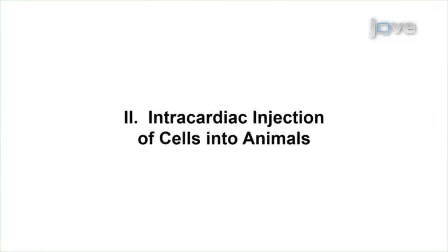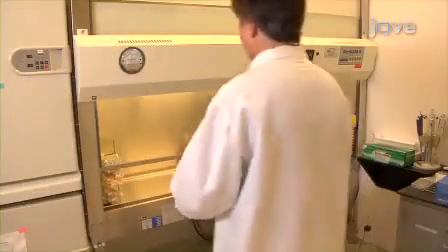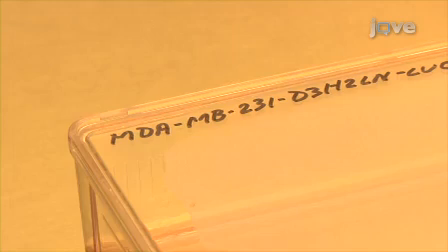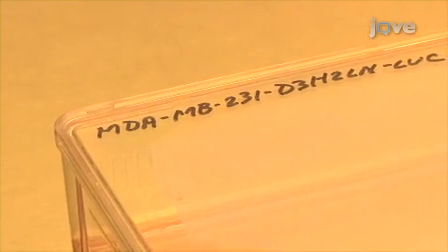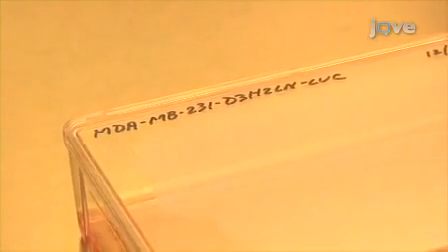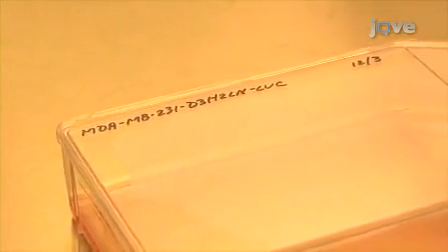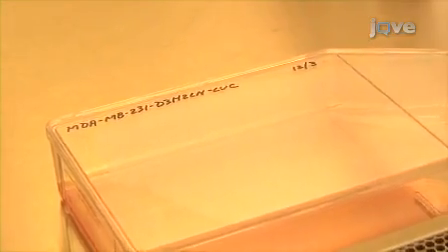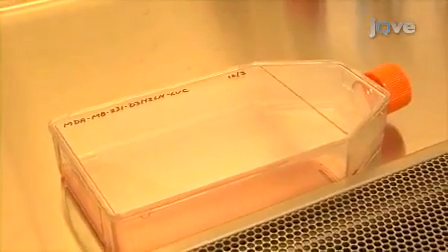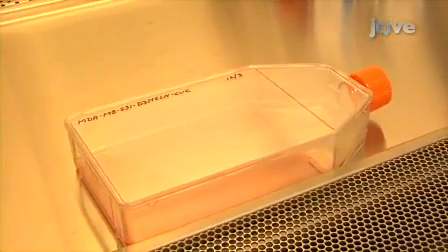In this experiment, cells from a human mammary tumor cell line expressing the luciferase gene will be used as an optical indicator of tumorigenesis in vivo. This cell line was created from a spontaneous lymph node metastasis that originated from a D3H1 mammary fat pad tumor and is known to aggressively form metastases. The cells readily grow in standard media with no need for selection of markers.